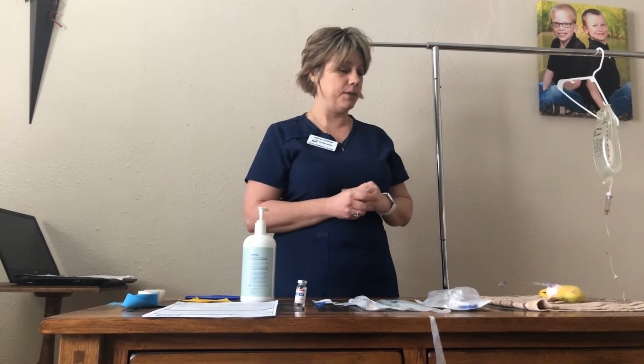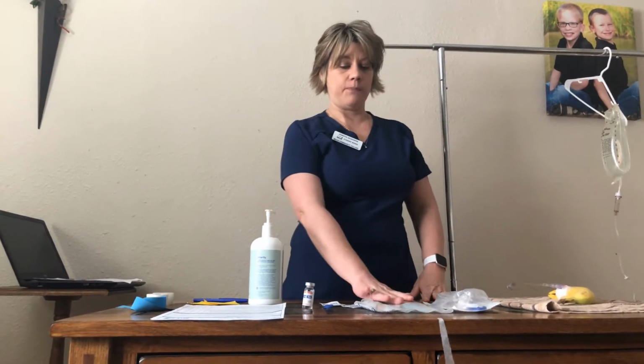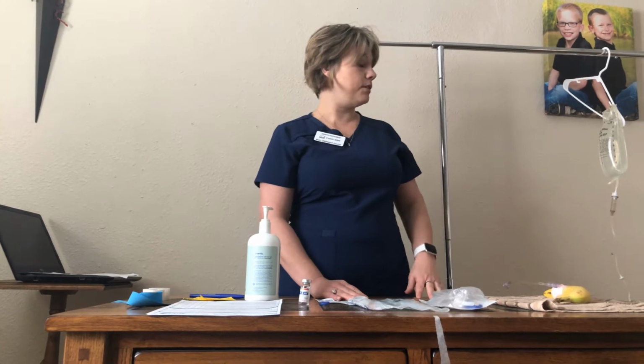I have my right patient. Ivy, can you give me your name and birth date as I scan your bracelet? And that matches up. Okay, Ivy, it is 10:30 and we're going to be adding your antibiotic to your piggyback, as a piggyback IV med. Do you have any questions on that?